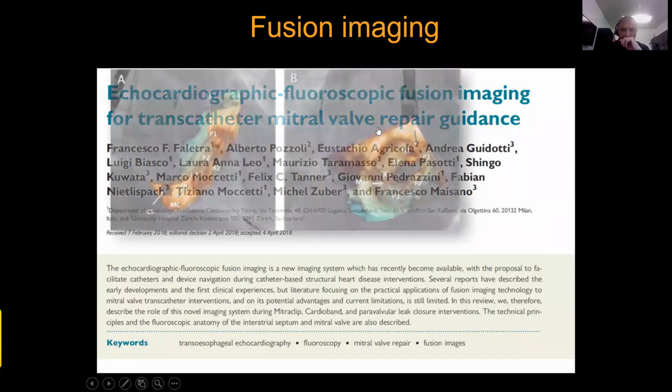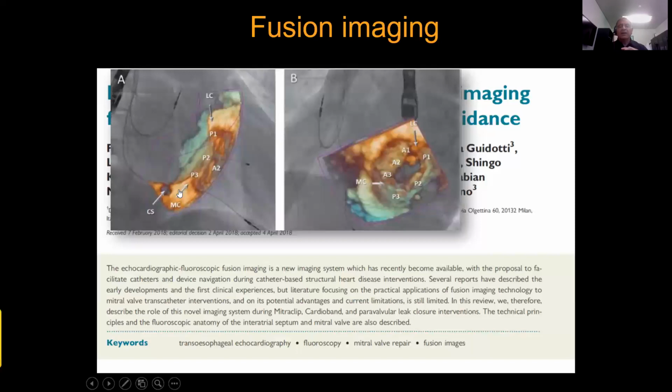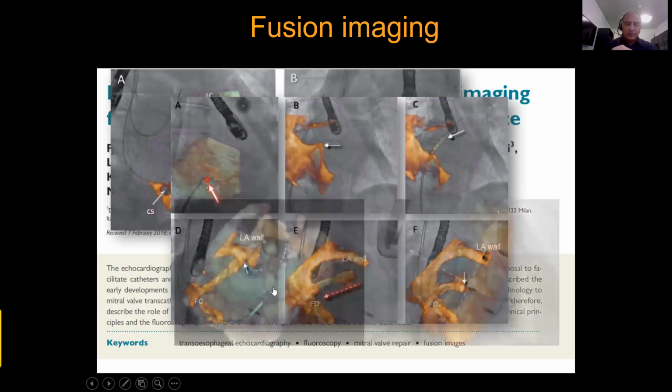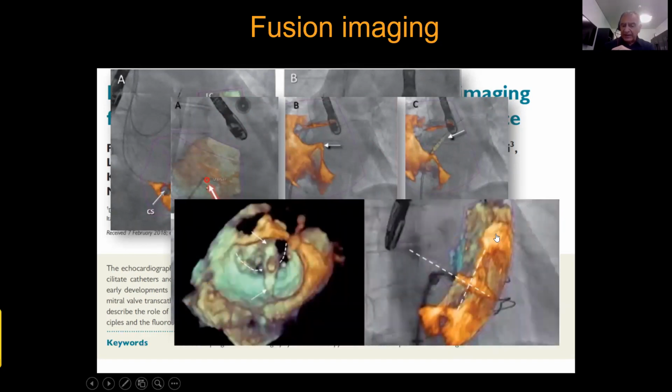You can see here, for example, the mitral valve in right anterior oblique projection, and you can see P1, P2, P3. This is how the mitral valve appears inside the fluoroscopy silhouette in RAO. And this is the mitral valve in LAO, which appears as if we were seeing the mitral valve from the left ventricle, which is exactly the LAO projection. Using fusion images, we can see the catheter and also the projection, and we will discuss. This just gives an idea of the evolution of imaging. We will discuss more deeply later.